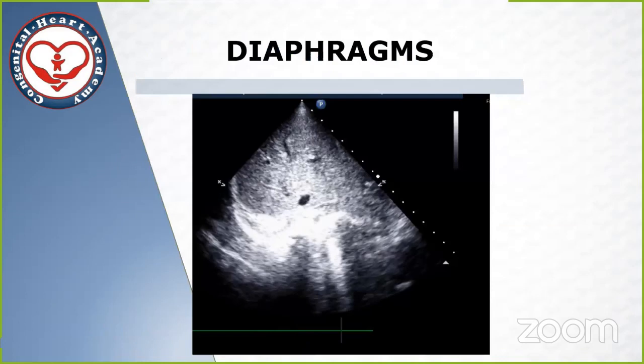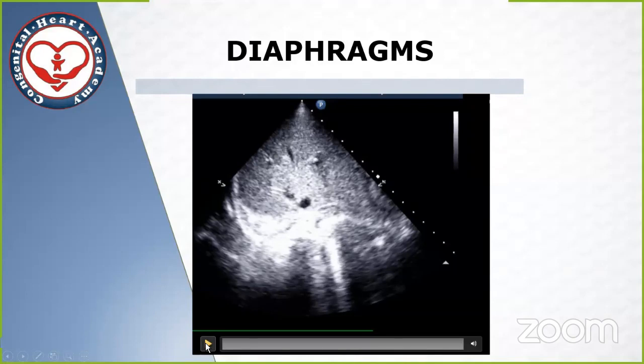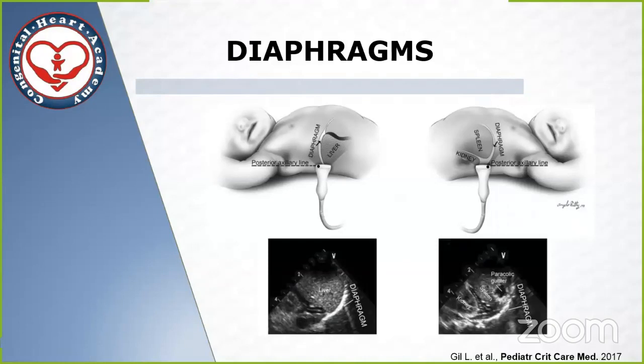But certainly one of the things that helps us a lot is the identification of abnormal diaphragmatic motion in the immediate postoperative period. From a subcostal routine view, it's very easy to identify a diaphragm that is not moving, and that has been described in many publications.